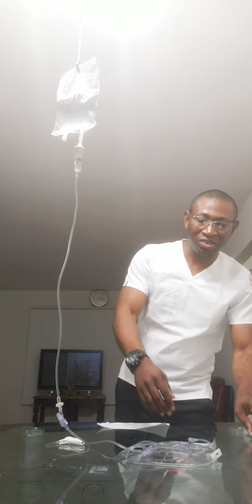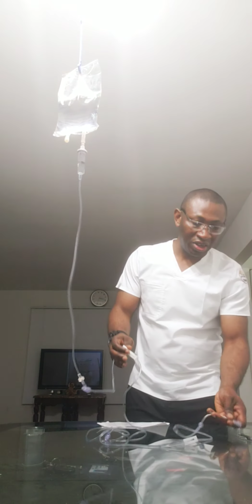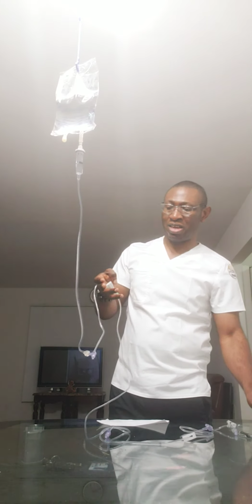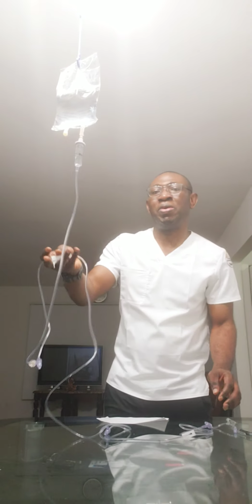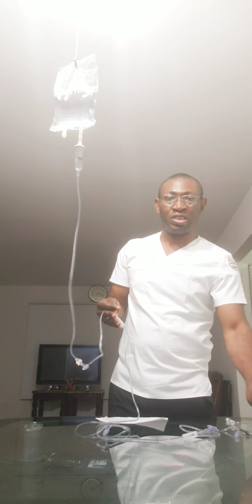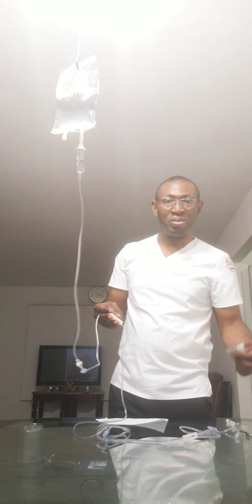If it is not compatible, what I'm going to do is get my medication, clean the port here, clamp it up here, flush it with normal saline, and after flushing, administer my medication, and flush it again with normal saline, and open up the port and allow it to flow, and I'm done. I'll make sure I clean the port in each section of the normal saline and the medication. But if it is compatible, fine, I go ahead.